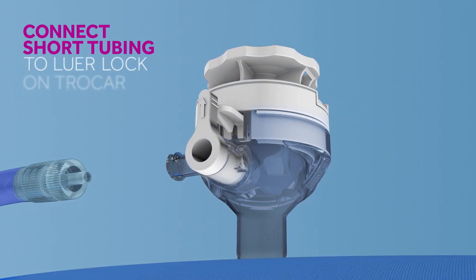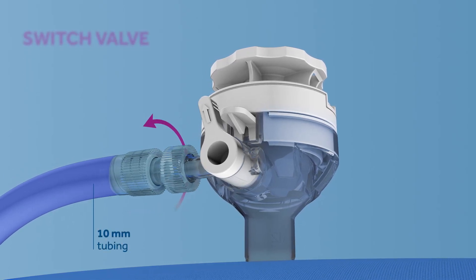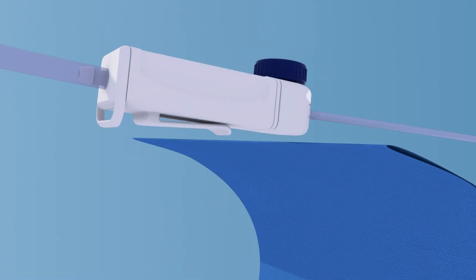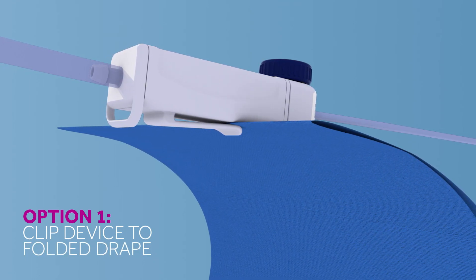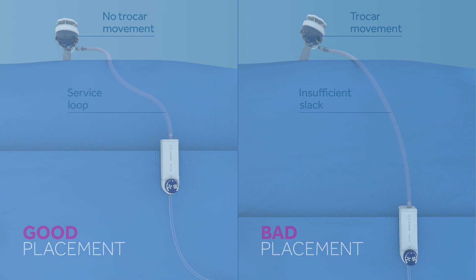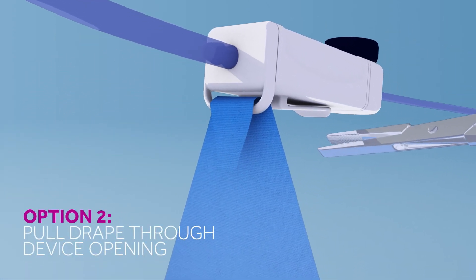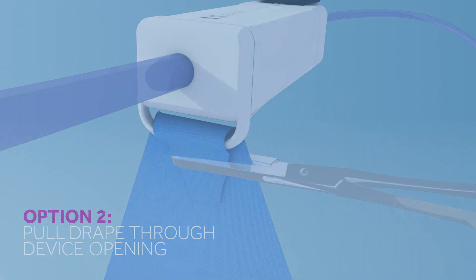Connect the shorter tubing to the luer lock on the trocar, and then switch the trocar valve to the open position. There are two options for securing the device to the drape. Option one is to clip the device to the folded drape — be sure to allow slack for movement of the drape. Option two is to pull the drape through the opening in the device and then secure using a surgical clamp, again allowing slack for movement.